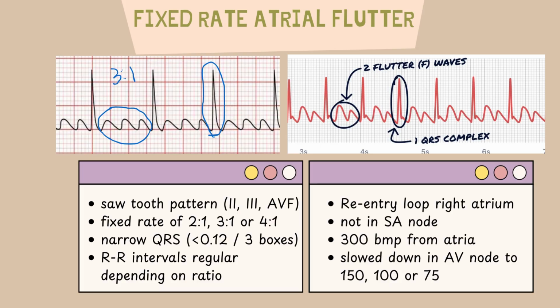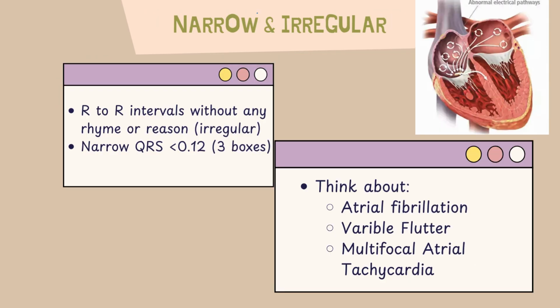Now we move on to the narrow and irregular rhythms. These are so fun. They're a complete disaster of a mess.